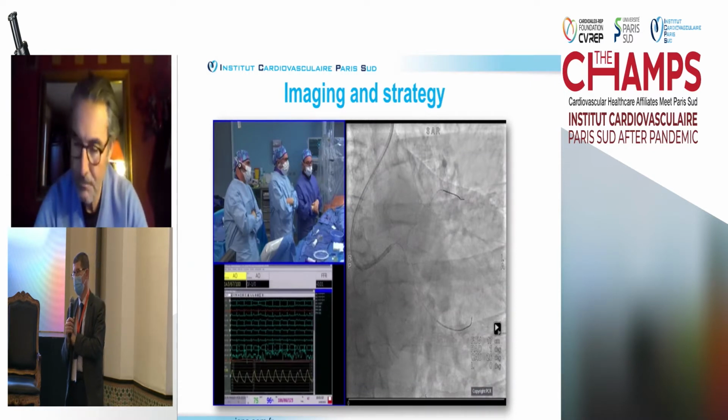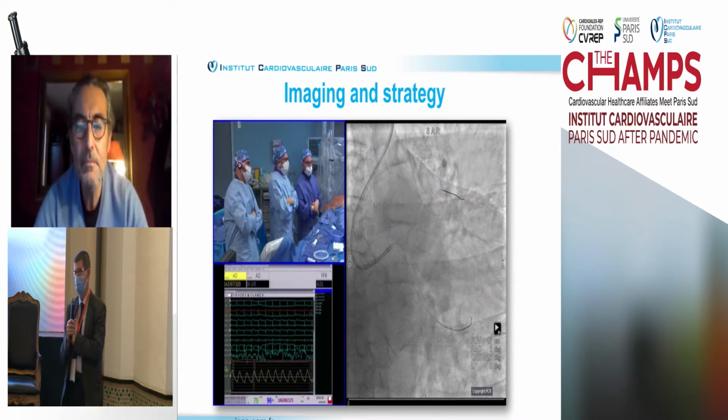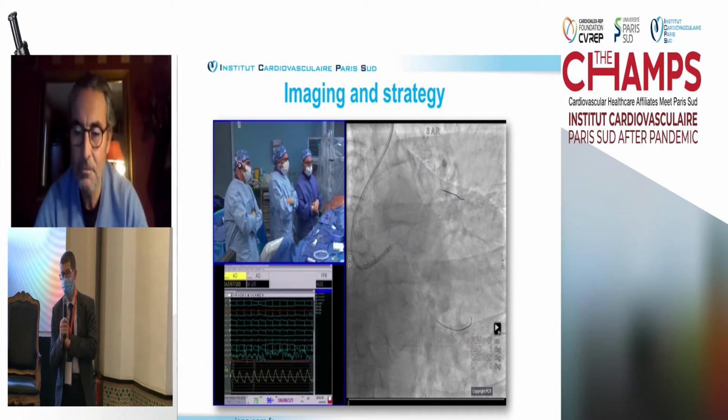Dr. Noumani, what's your opinion? Actually, I agree with Professor Saïd. I will fix the LAD and left main first to save the patient's left ventricle, and I will try for the diagonal. Even if it is maybe more difficult as a second step, I will fix the LAD and distal left main first. And my co-chairman, Dr. Khalid Shokri.